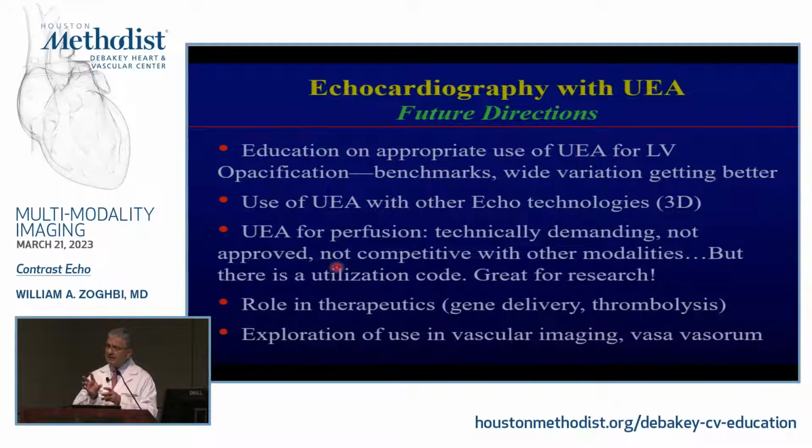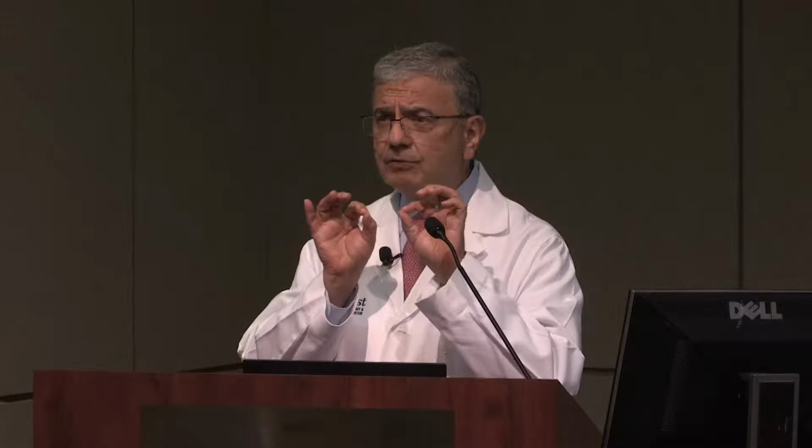Actually, with very high mechanical index, if you don't have any protection or if you're just on top of the organ, you could have some microcapillary disruption and extravasation into the medium. So some of these applications are for gene delivery, targeted depending on where the organ is.